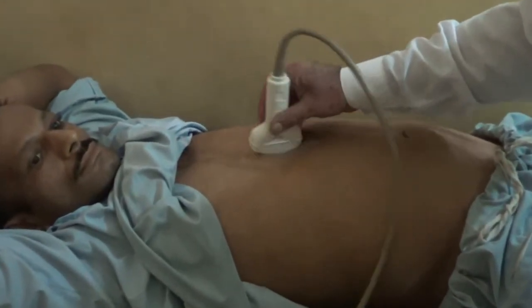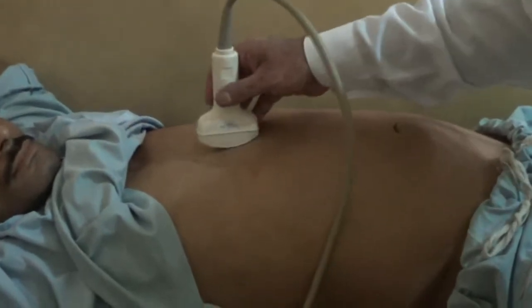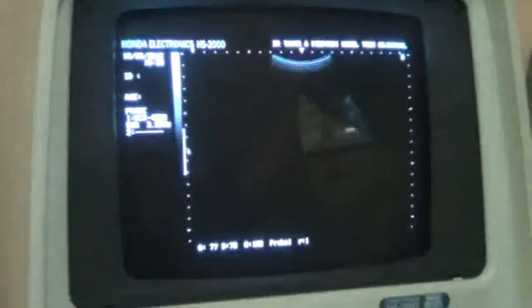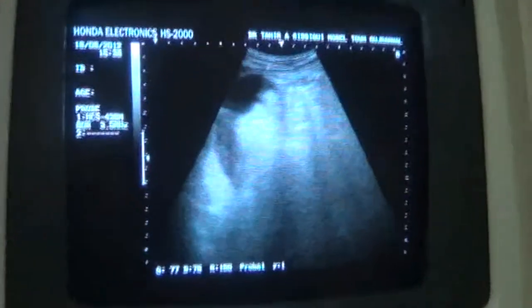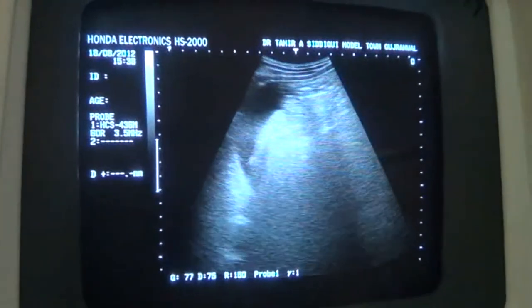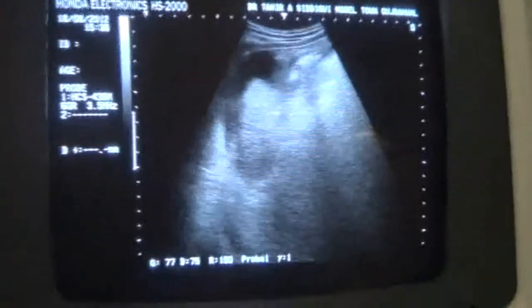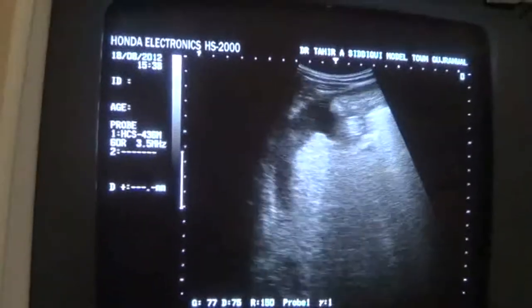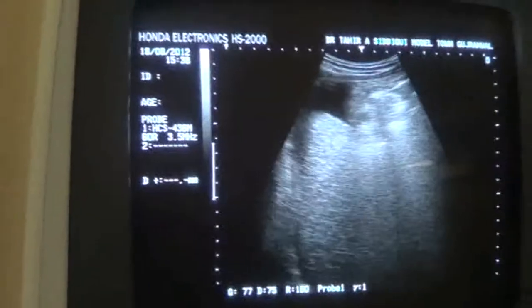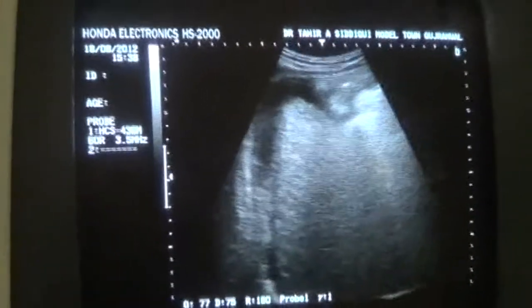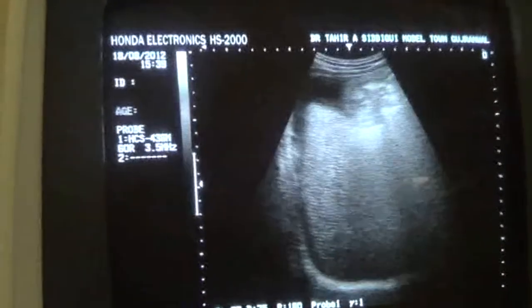We are going to scan in a systematic way, starting from the liver. Scanning below the costal margin, I can see fluid — this is the fluid. So it means there is ascites. When I move the transducer towards the patient's right clavicle, I see a cirrhotic liver.